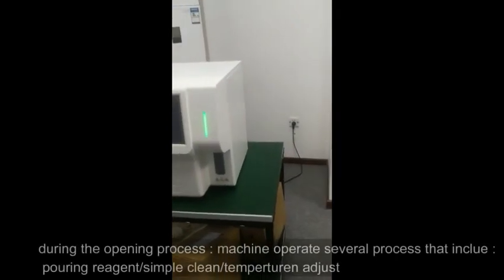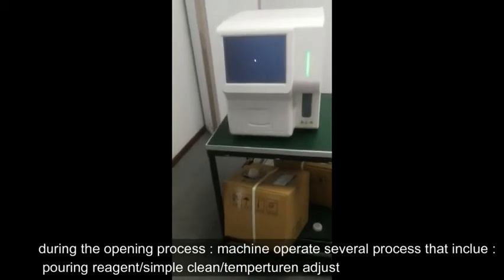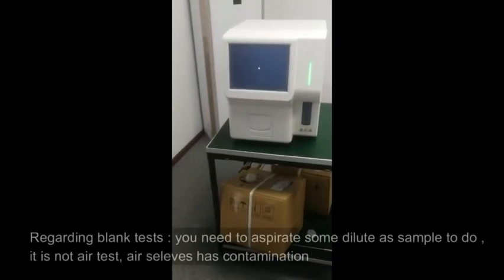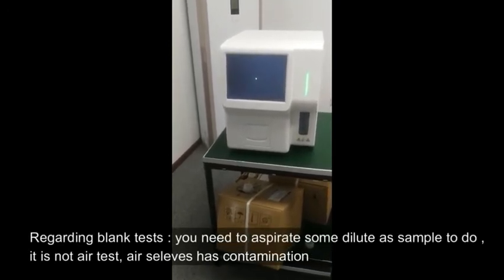During the opening process, the machine performs several processes that include pouring reagent, a simple clean, temperature adjustment. Regarding blank tests, you need to aspirate some diluent as sample to do the test — it is not an air test, as air itself has contamination.